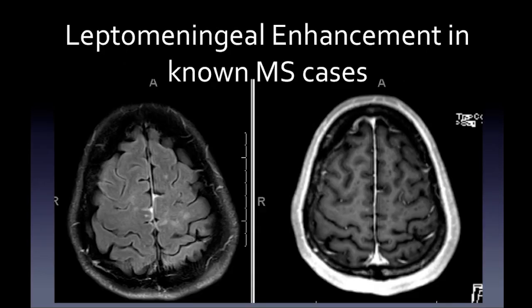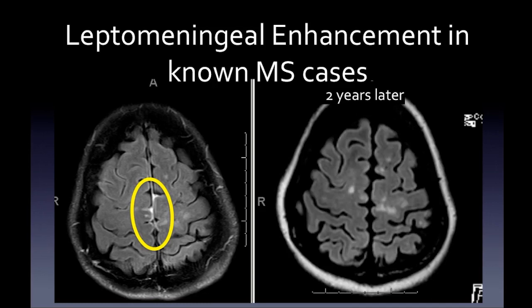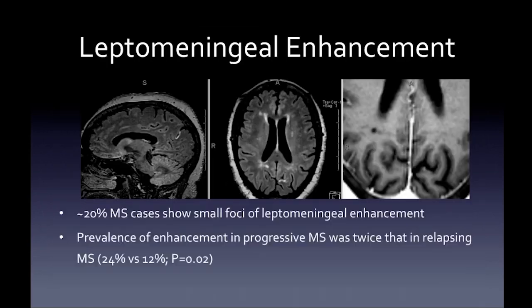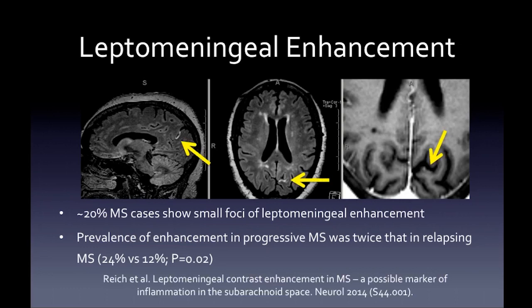Leptomeningeal enhancement is possible in known MS cases — about 20% show small foci of it, which can simply be a sign of active cortical inflammation. In this case, leptomeningeal signal on FLAIR and post-contrast T1 preceded development of more cortical and subcortical lesions two years later. Don't be alarmed if you see this in a known MS patient, but if the patient is not diagnosed with MS, consider other explanations — we'll cover those in part two.